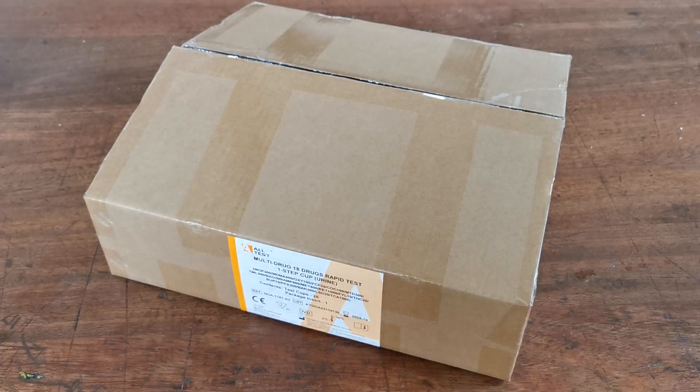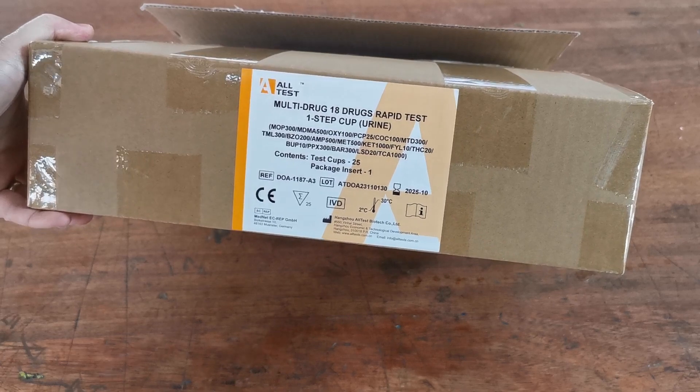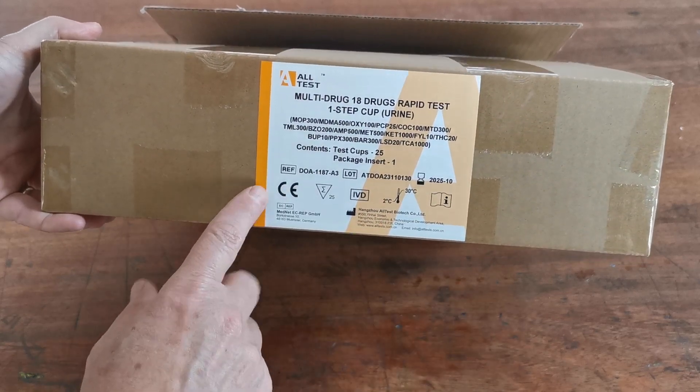Welcome to this combined Valumet and UK Drug Testing presentation and product demonstration of the new multi-drug 18-in-1 Ultra Cup from UK Drug Testing, made for us currently by Altest. This combination is 18 drugs in a single collection cup, and let's just run you through the package label.